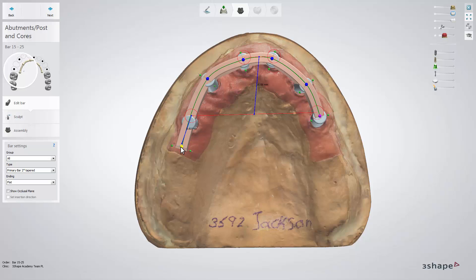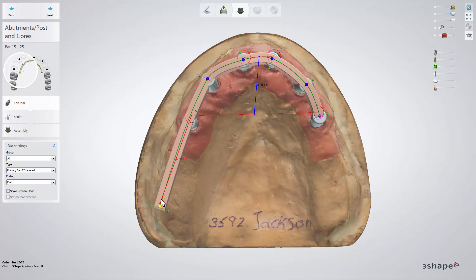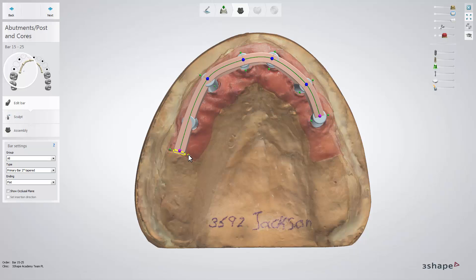The software will generate an initial suggestion for the bar and the bar interface abutments. Now you can start editing the bar using the control points that appear when you hover the mouse cursor over the bar. Points when activated enable you to change the bar shape.